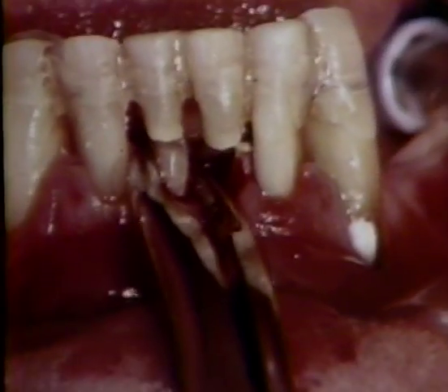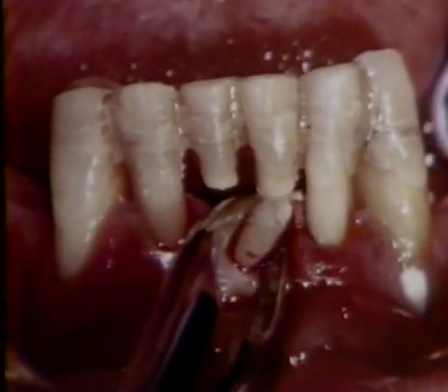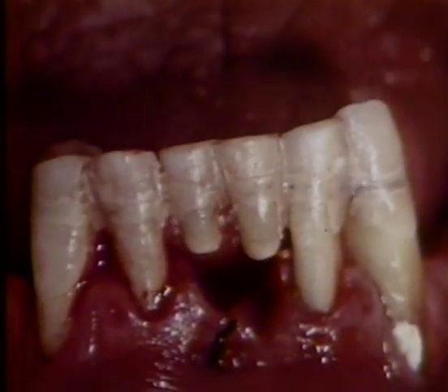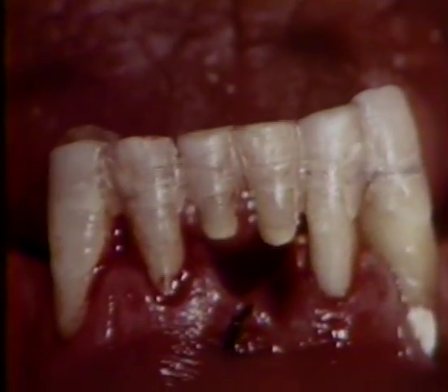There is enough alveolar support remaining around the lateral incisors and canines to use these teeth for prosthetic abutments. By employing this technique, it is not necessary for the patient to wear a removable partial denture during the surgical elimination of the periodontal pockets.